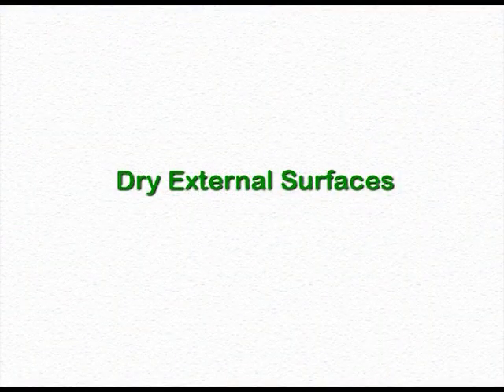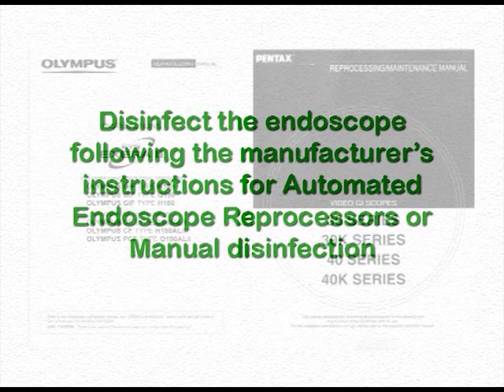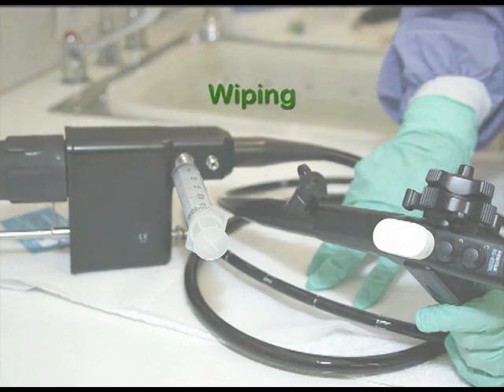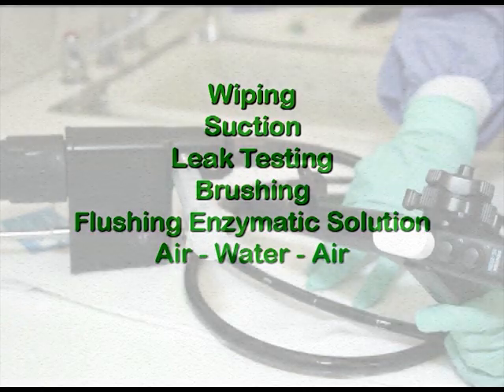Pat dry the outer surfaces of the endoscope with a soft lint-free cloth prior to manual disinfection or automated reprocessor usage. Disinfect the endoscope following the manufacturer's instructions for automated endoscope reprocessors or manual disinfection. The same principles apply to the cleaning of Pentax and Fujifilm endoscopes: wiping, suction, leak testing, brushing, flushing with enzymatic solution, air, then water, followed again by air.